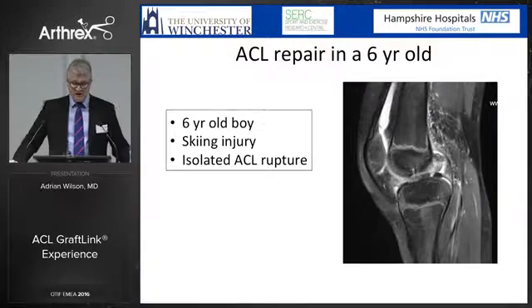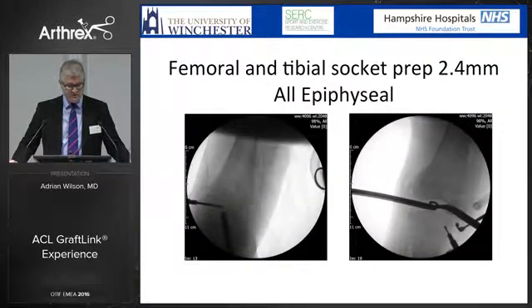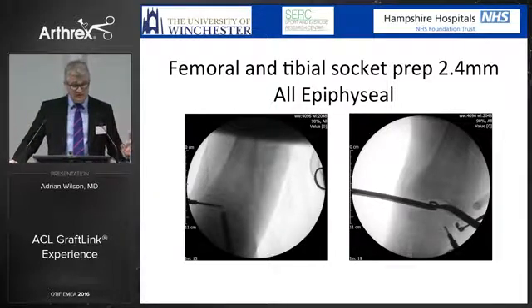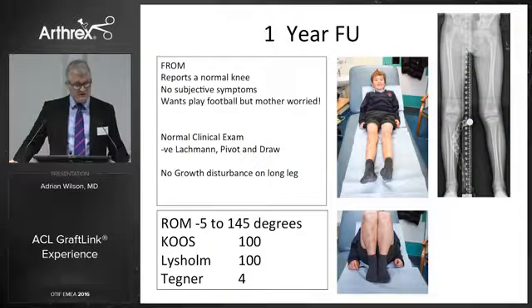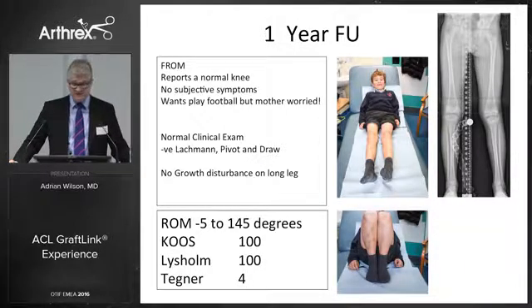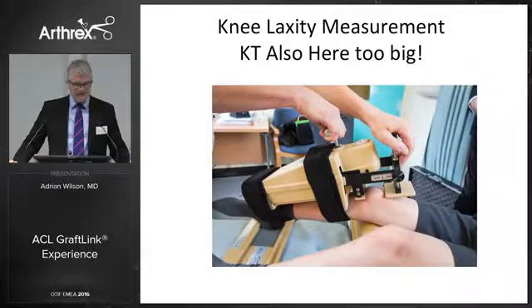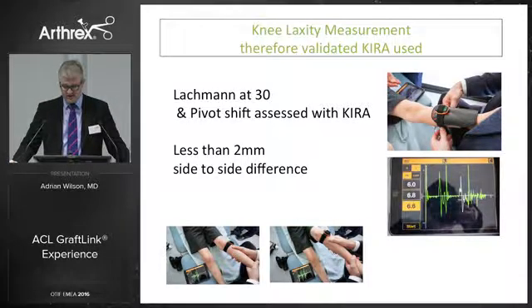So again, a very small Tanner 1 child. We did the all-epiphyseal technique, and importantly, we can do this through 2.4 millimetre tunnels. So we're not burning any bridges with these children. We see this child at a year, and again, full range of motion. The only reason why his Tegner is low is his mother won't let him play football yet, although he's desperate to get back. Again, the KT far too big. So we use this Kira device, which has been validated, and we have less than 2 millimetre side-to-side difference.